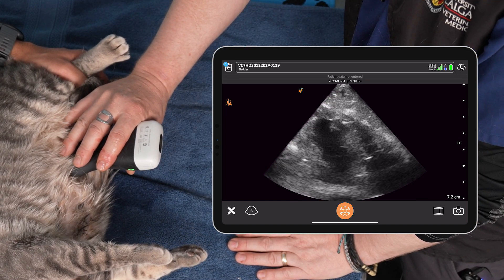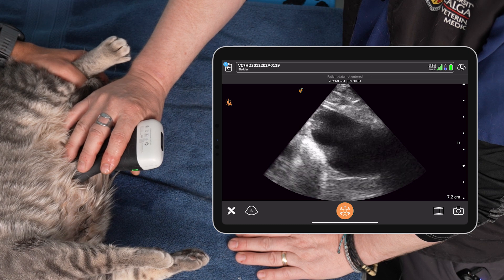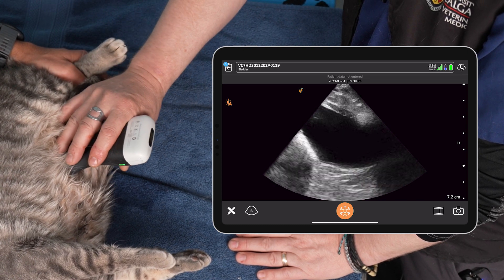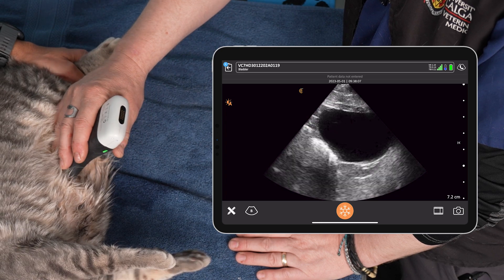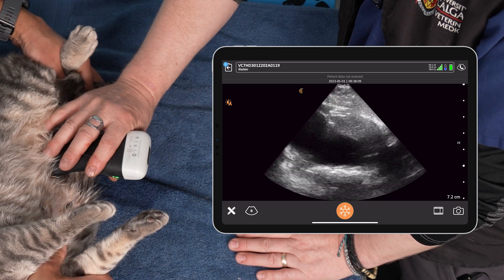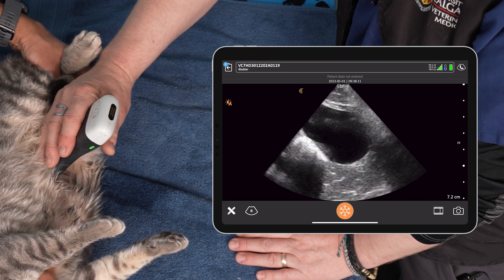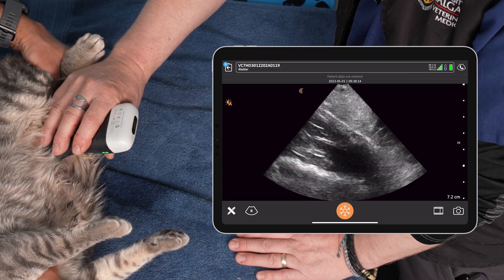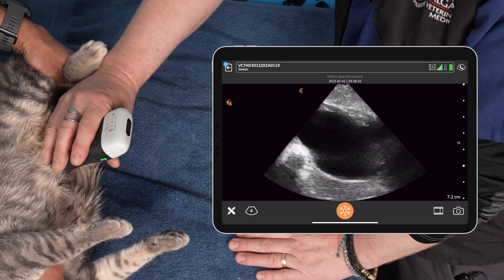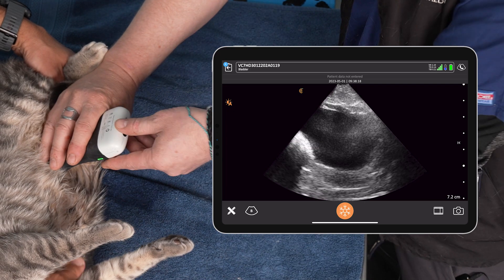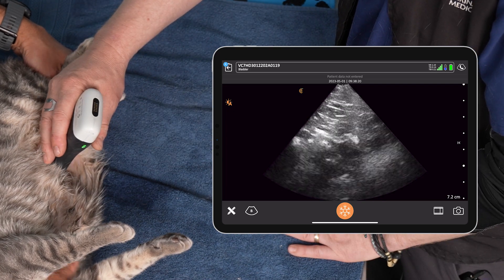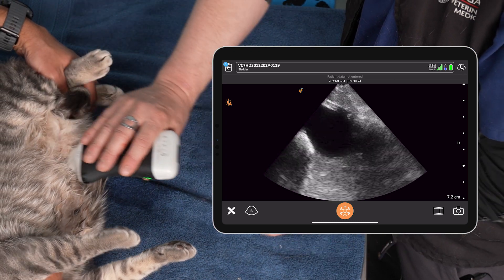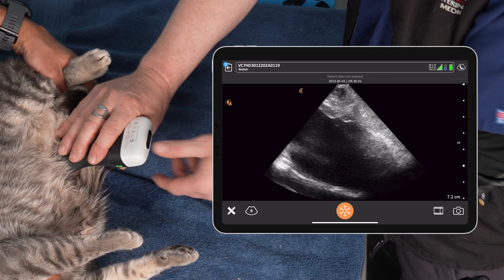Once we've identified the urinary bladder, the first question is: is there free fluid at this site, yes or no? Cern is going to fan from side to side until the bladder disappears, looking for free fluid. Make sure you check the apex of the bladder and come back to check both the trigone region and the apex. Our cat is in lateral, so we want to angle the probe down toward the body wall to make sure we don't miss fluid — that's different from if they were standing.